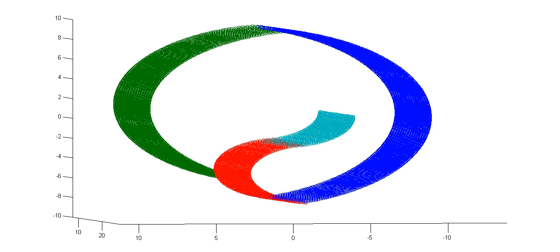But voxel by voxel is hard, and I think a lot of the attempts to go across individuals have to reduce the voxels into some lower-dimensional space that they can claim is common to both brains. So doing the multi-voxel approach allows for maybe picking up signals that are harder to see in individual voxels. An example is orientation tuning in the visual cortex.